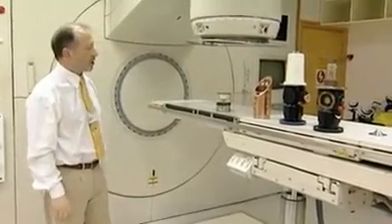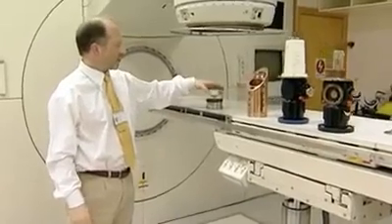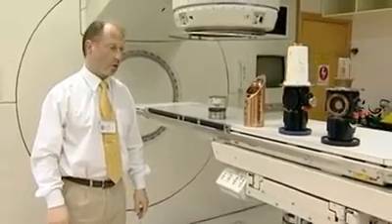Here we have some individual components of a linear accelerator. If we look at them very briefly, each individually, we can see how they fit together for the operation of the whole unit.